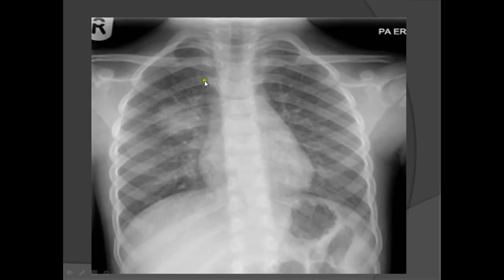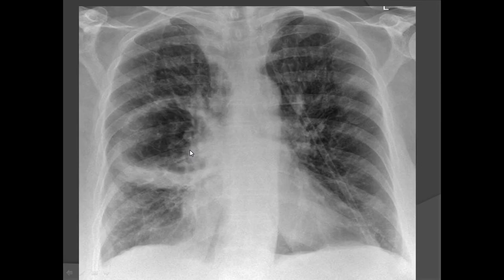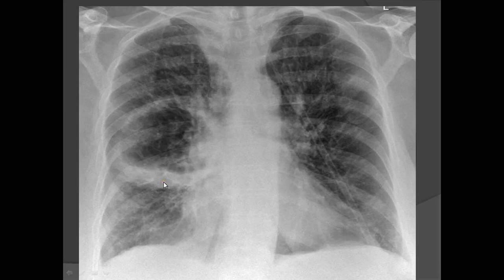Lung abscess: whenever you see an air-fluid level within a cavity in the lung, always think of lung abscess. Obtain an additional lateral view to confirm whether it is a lung abscess or empyema. Another thick-walled cavity with an air-fluid level, along with multiple reticulonodular shadowing and patchy consolidations, again represents a lung abscess.